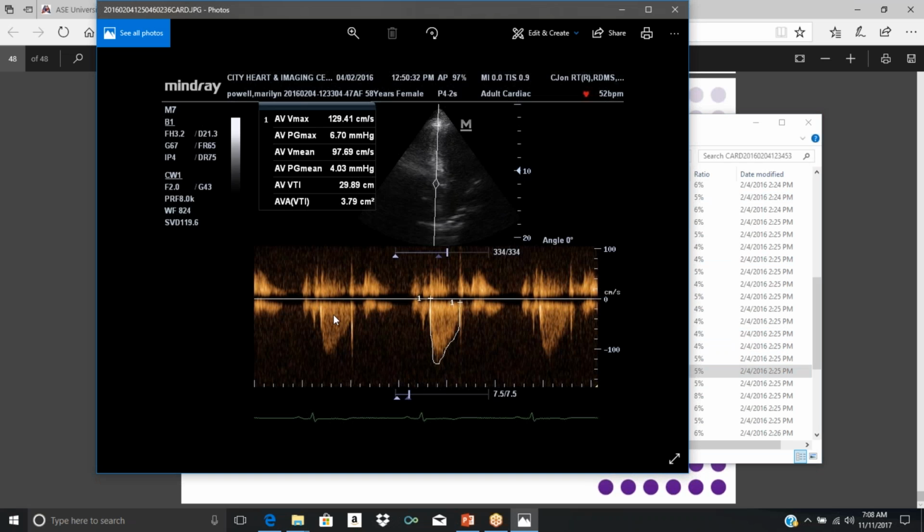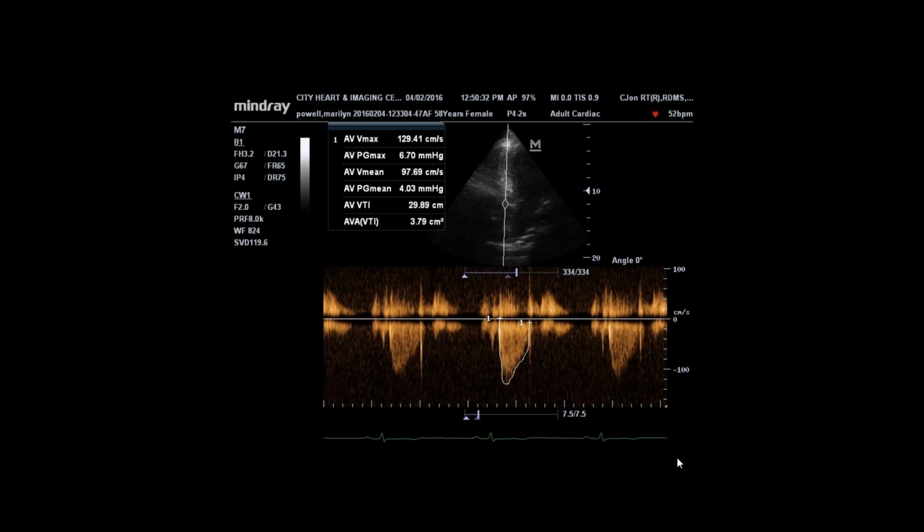Okay, again, this is across the aortic valve though. So you move a little bit lower. You move from the left ventricular outflow tract into the aortic valve itself. And we usually use CW Doppler because if you have something like aortic stenosis, you need a Doppler evaluation of a high velocity flow. So once you move into the aortic valve, you should switch to CW Doppler. It's a systolic flow below the baseline because it's flow across the aortic valve.